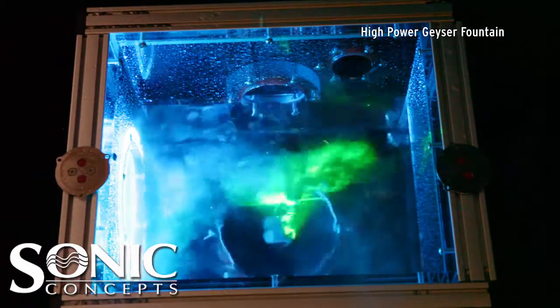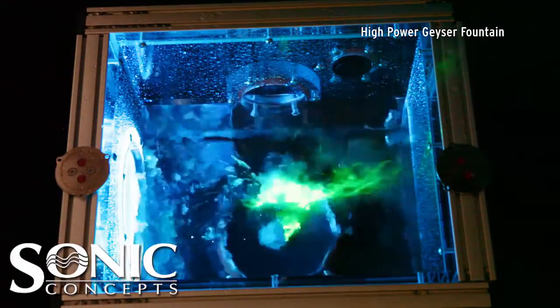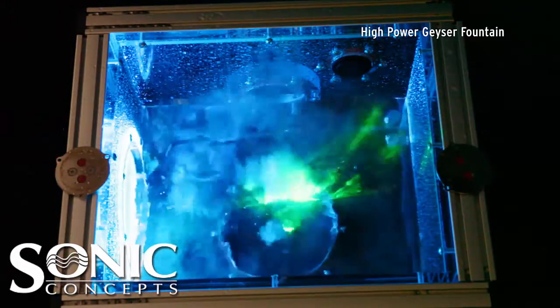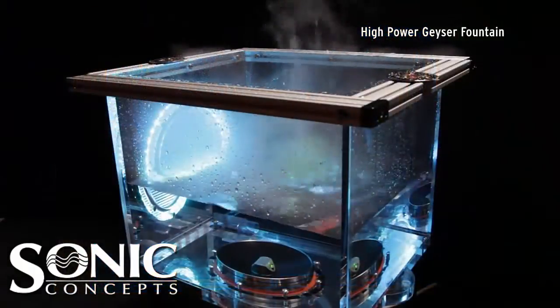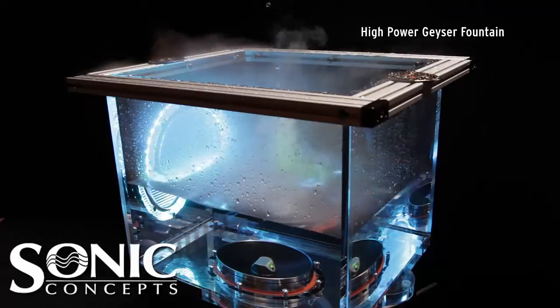The power is increased and the water surface is lowered to the focal plane. An aerial view captures the violent water jets produced by the high-intensity displacement at the water-to-air interface. As the beam is laterally steered, the pulsed HIFU energy creates the HIFU geyser fountain effect.